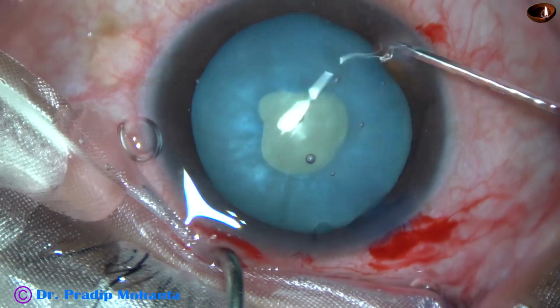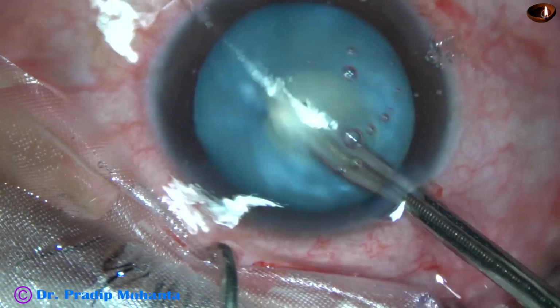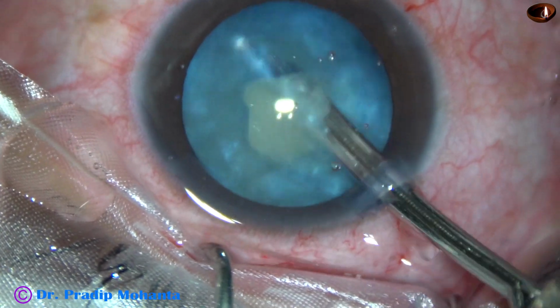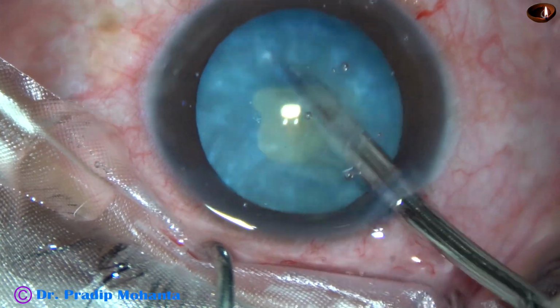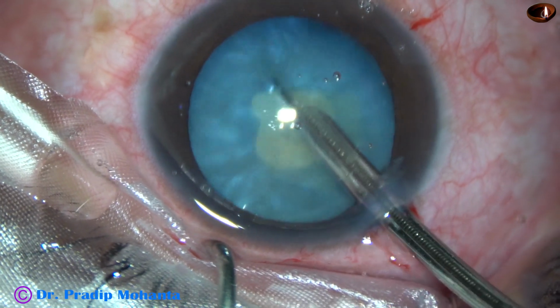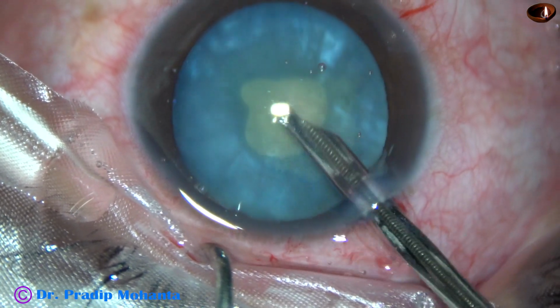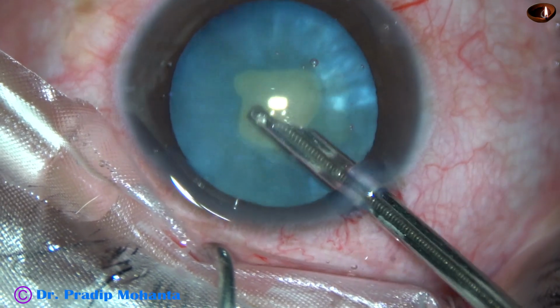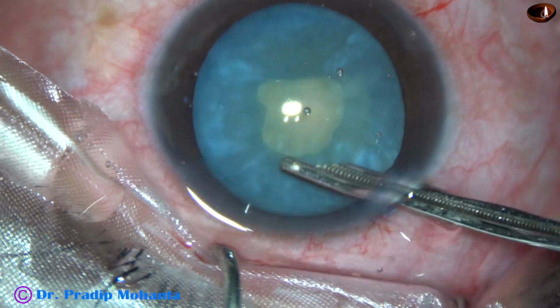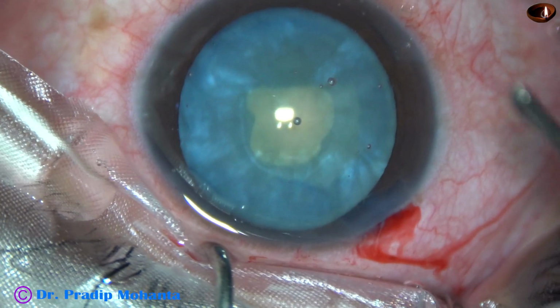And as soon as we make a puncture on the anterior capsule, the punctured site may run to the periphery, thus causing an Argentine flag sign with blue on two sides and white in between. But if we do it this way, and if we do a small rhexis first and aspirate the cortical lens matter in this way, the intralenticular pressure decreases and the cataract behaves in a completely different way after decreasing the intralenticular pressure.